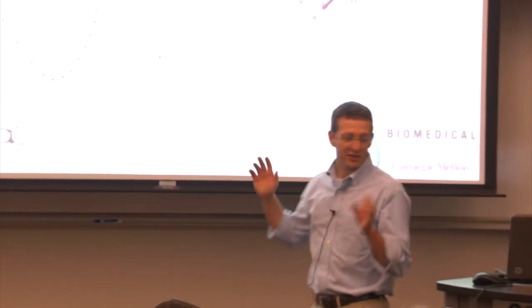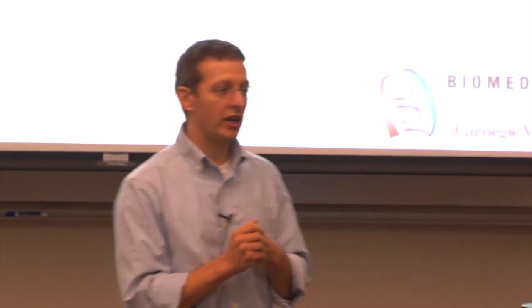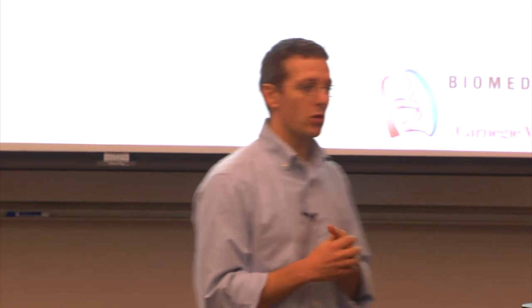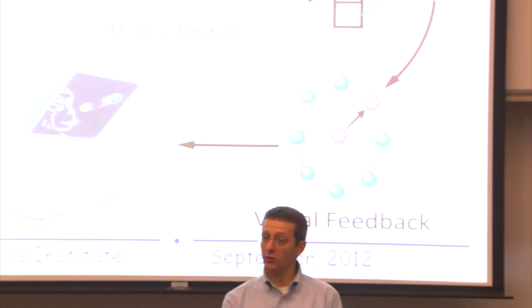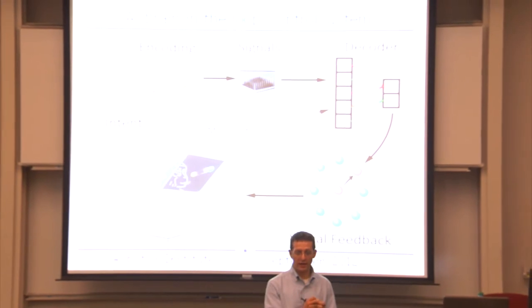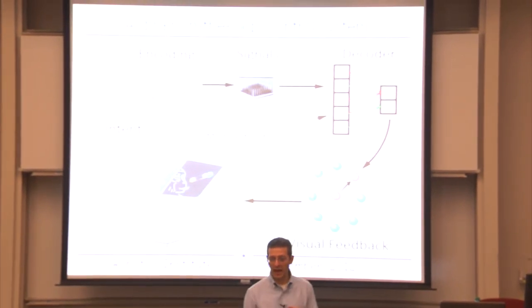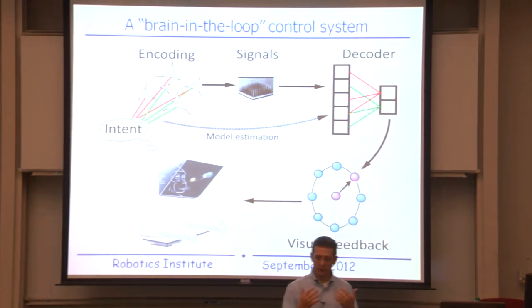So as the title implies, I'm going to talk a lot about neural prosthetics. And the idea behind neural prosthetics is pretty simple. We have a patient who's spinal cord injured or suffers from some other motor disorder where the brain is entirely intact, but for whatever reason, they can't communicate signals to the muscles and actually interact with the external world. And what we would like to do is design a device that can read out motor intention signals from the brain and then use that signal to directly actuate either a cursor on a computer screen or a robotic arm, and restore the ability for these patients to interact with the external world.